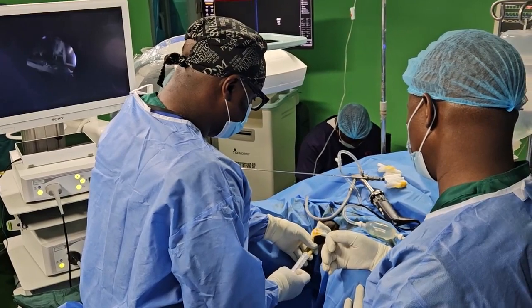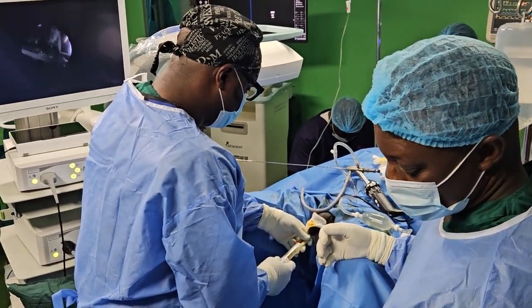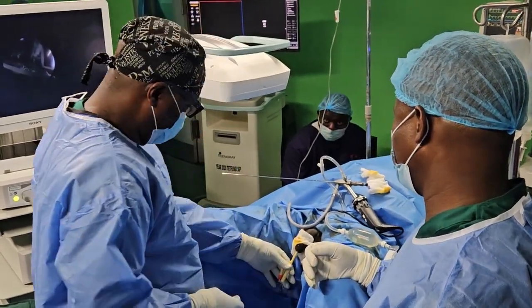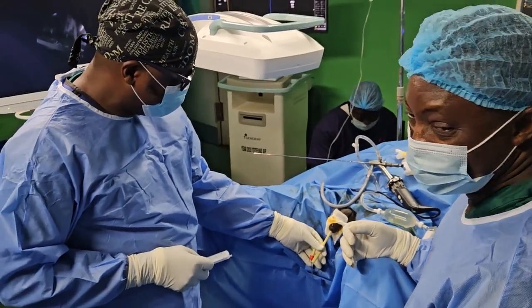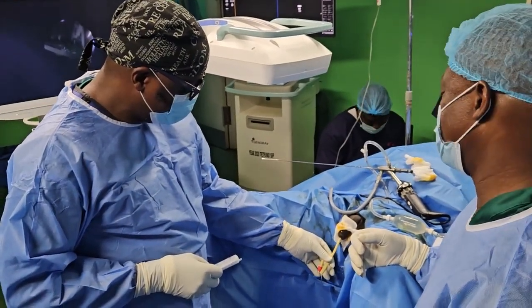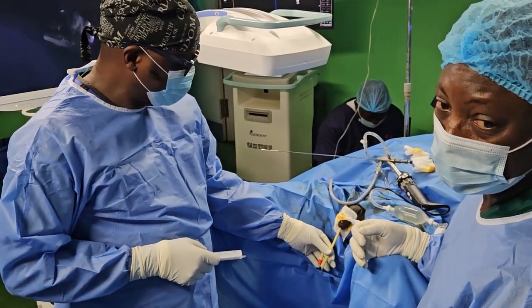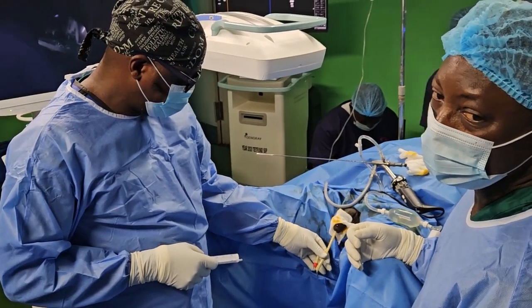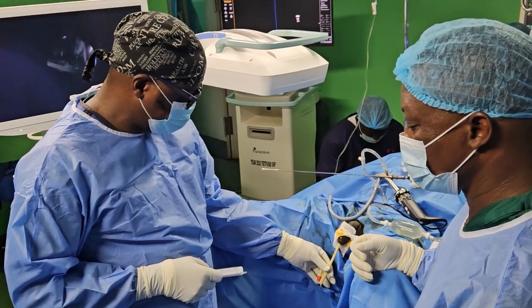Professor Ahmed, I think Alabi also doesn't like excessive fluoro, so this will also limit the fluoro exposure. In fact, the less fluoroscopy we have, the better, because of the radiation. Absolutely. This radiation is not just a story; it is real.